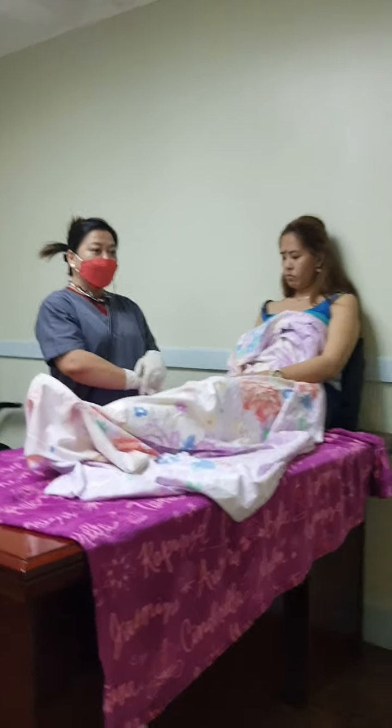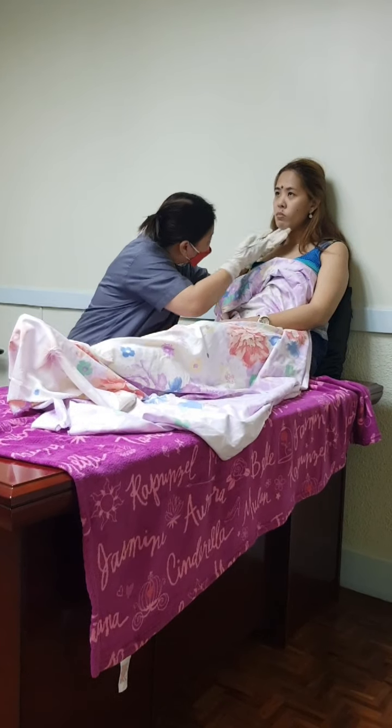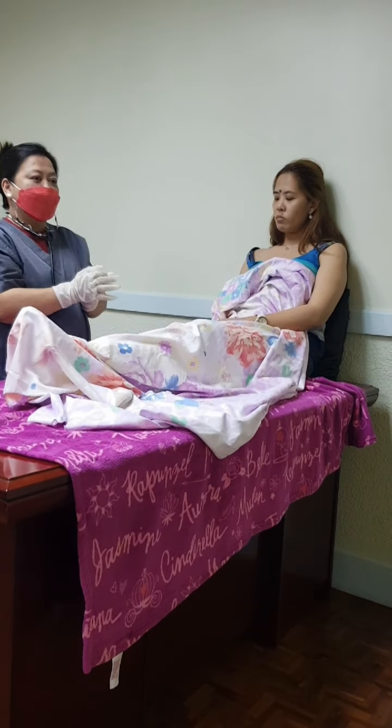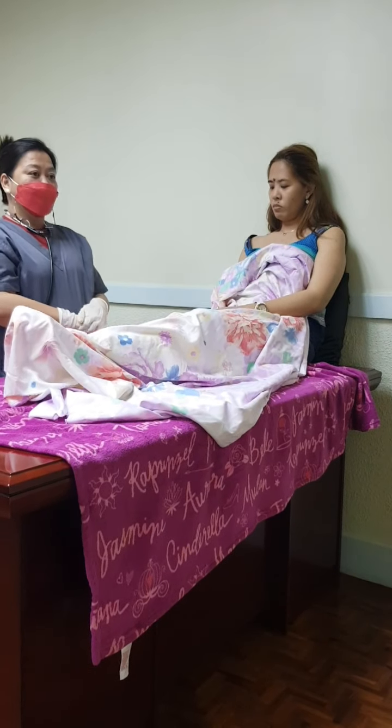Select the nostril through which air passes more easily. The tube passes more easily through the nostril with the largest opening.